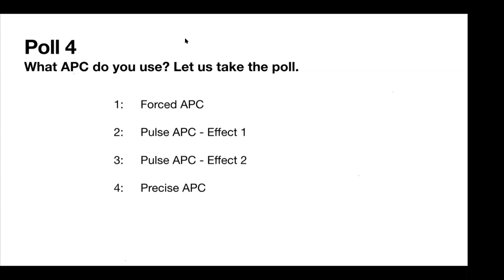One thing is, you need to understand that in electrosurgery, as long as you know how to use your electrical current to the desired effect, that is the most important thing, because there are so many other variables that will impact. And you could do the same job with any one of these settings.